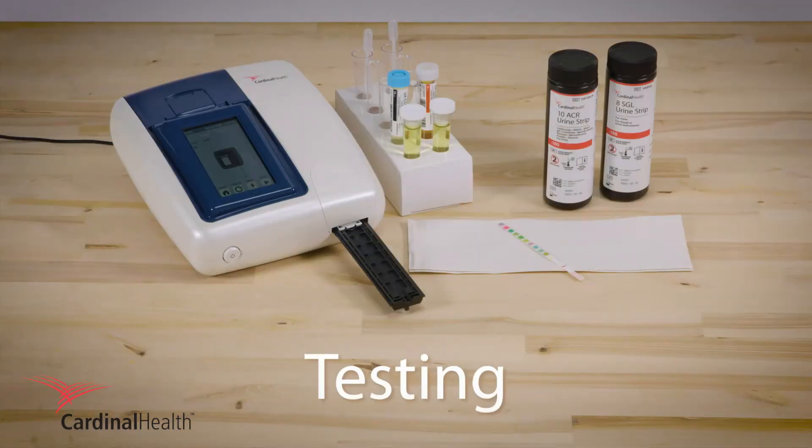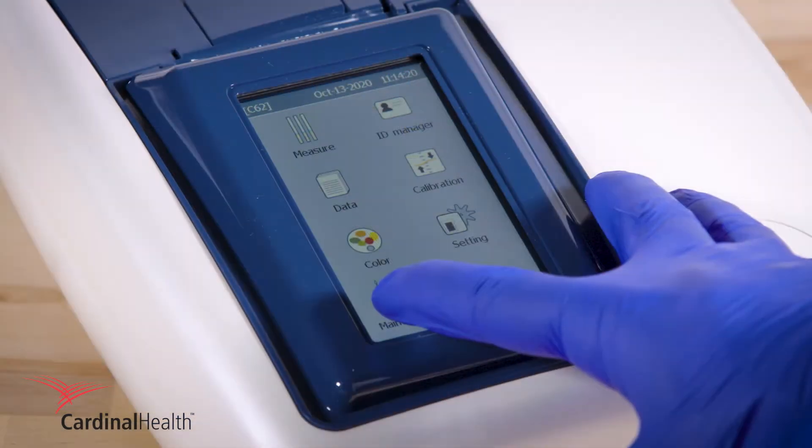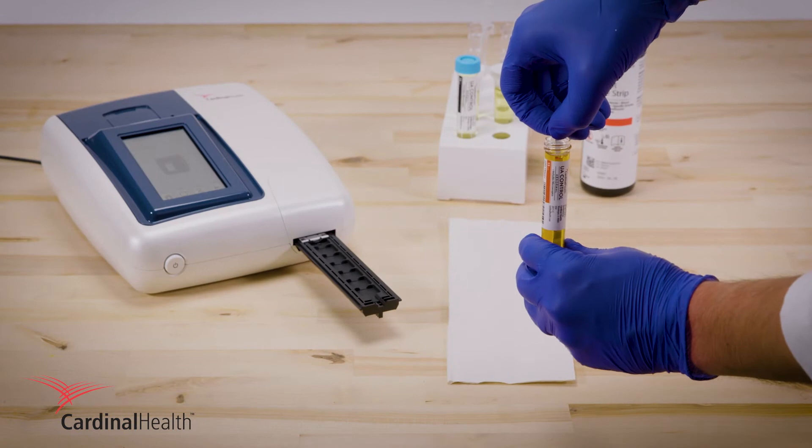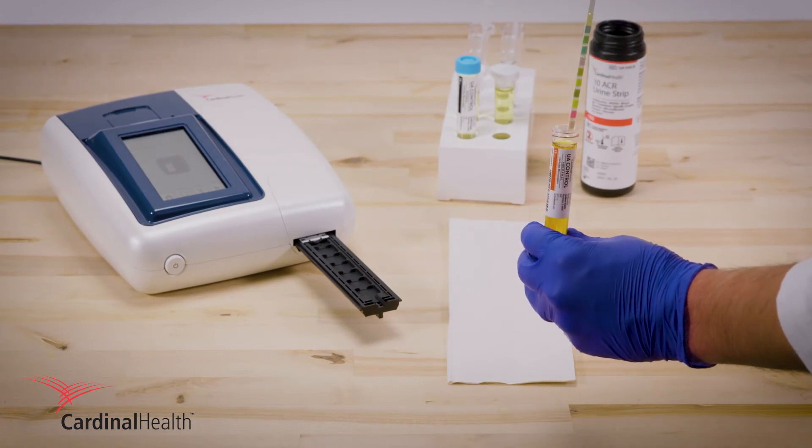To test patient samples or controls, press measure to prepare the device for sample analysis. Dip the test strip in the tube for one second, then tap it on a paper towel.